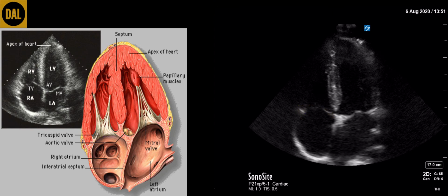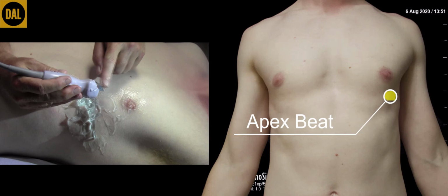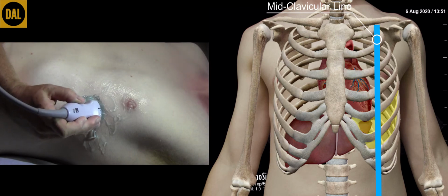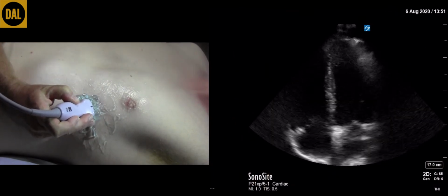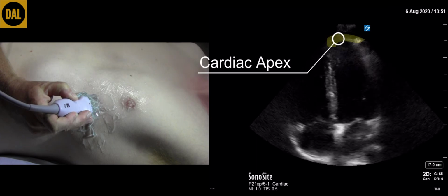Okay, so now we're ready to start scanning. The transducer is placed in a rib space close to the apex beat. This will usually be in the 5th or 6th rib space in the mid-clavicular line. Slide the transducer cranially or caudally to find the best rib space. Then slide the transducer medially or laterally within that rib space to obtain the best view of the apex.